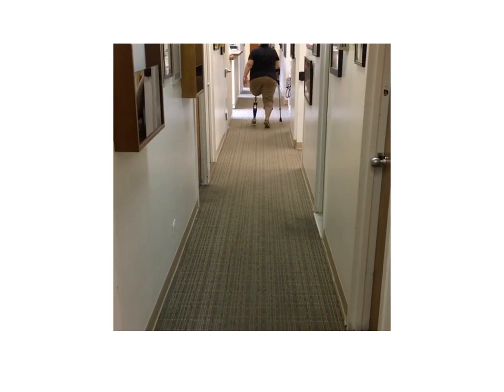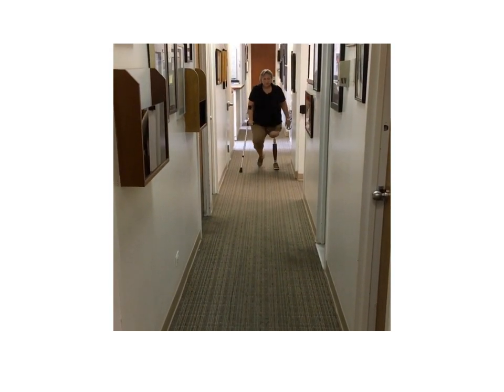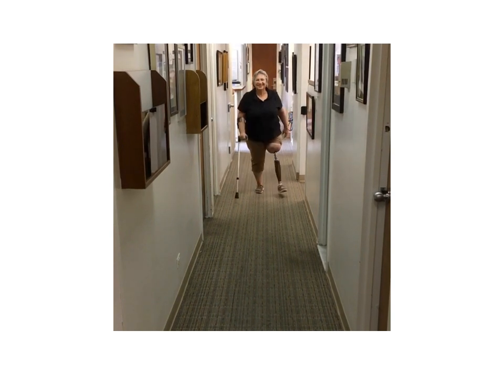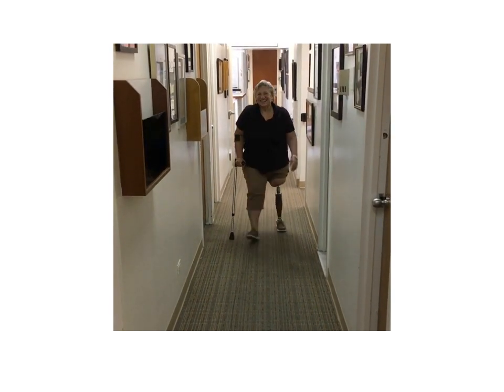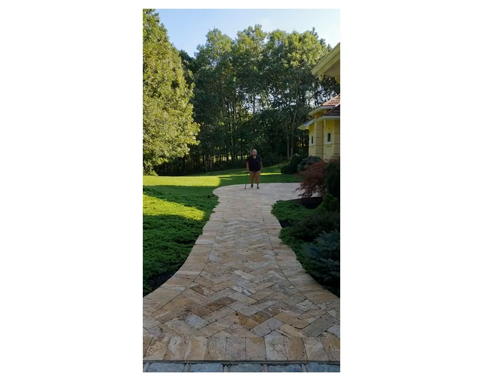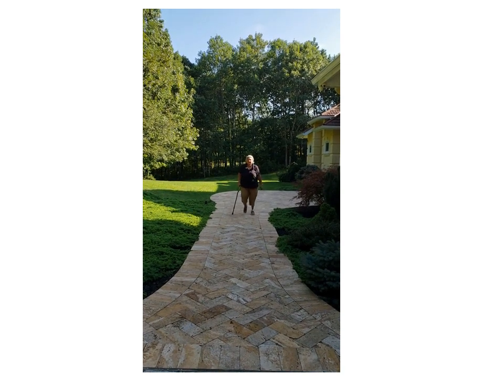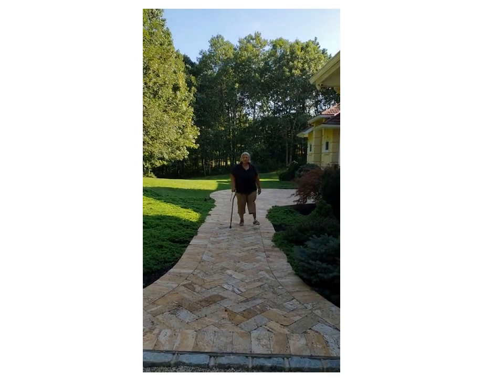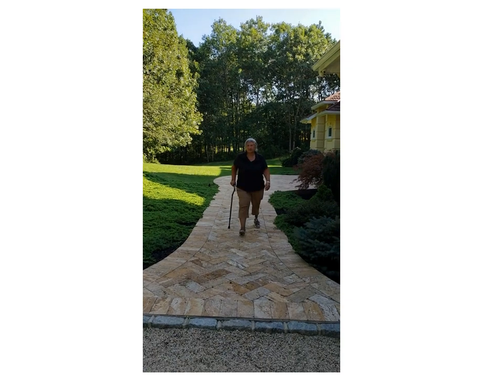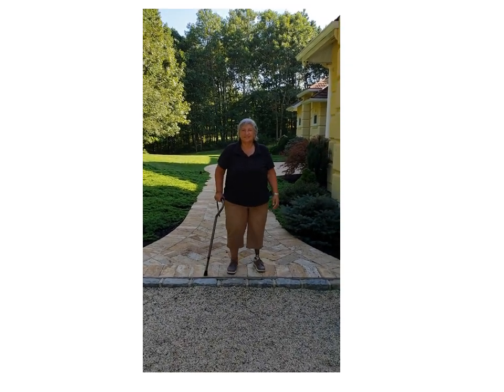At two months, Gail is walking pretty well and better than she was when she had the socket. She is happy with her progress. At about four months, you can see her function has further improved. She is barely using a cane at this point and has made great strides compared to her preoperative situation.